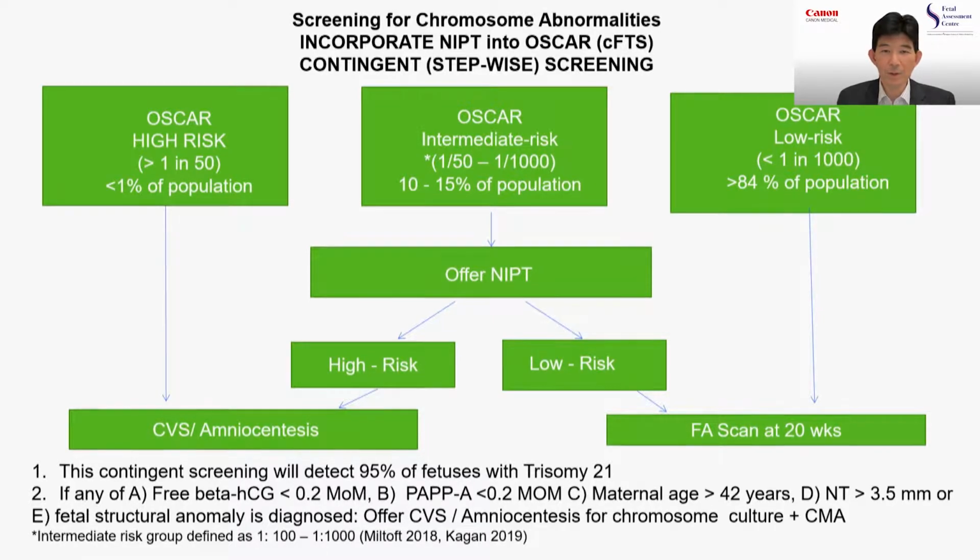Of course, now we also have contingent stepwise screening, whereby you can actually do an OSCAR or combined first trimester screening, but you triage them into low risk, intermediate risk, or high risk, and you can decide to offer your high risk patients, i.e.